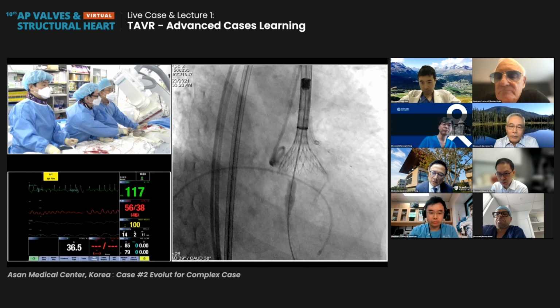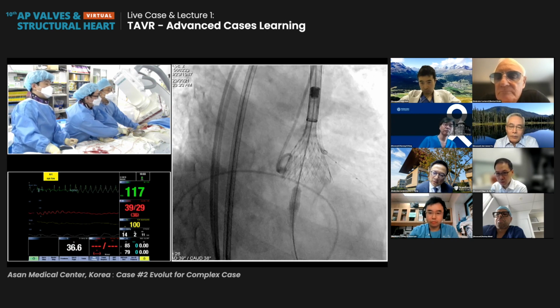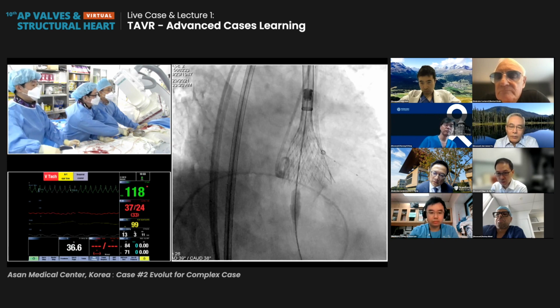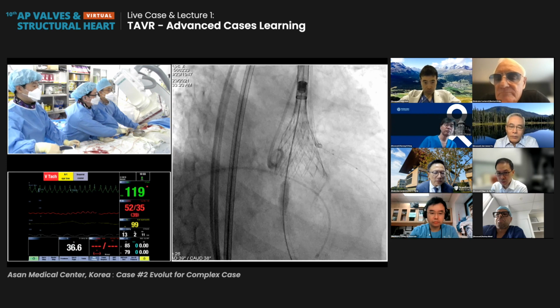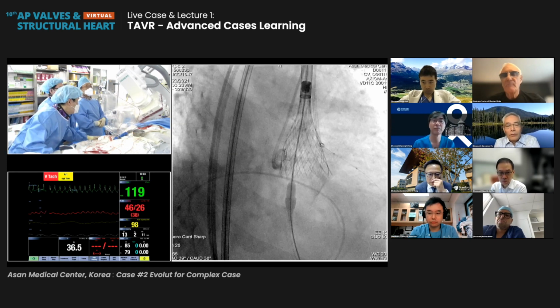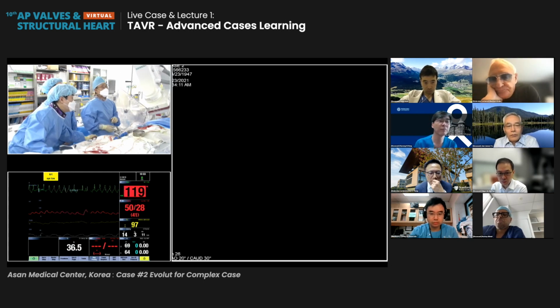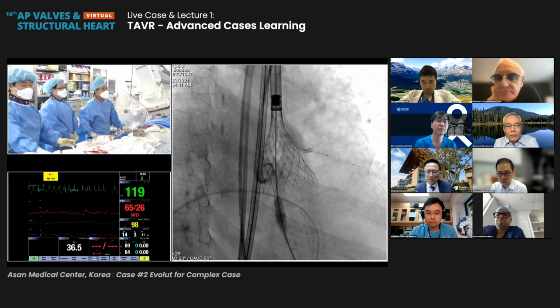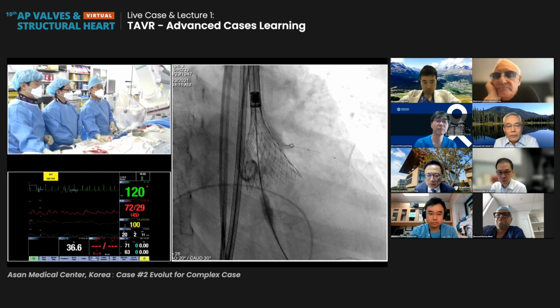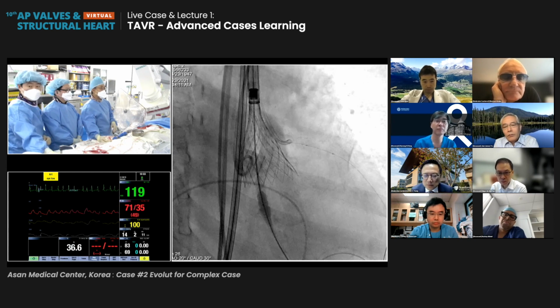자, 천천히. 자, 테스트. 자, 릴리스. 오케이, 릴리스. 혈압 조금 떨어집니다. 오케이, 릴리스. 올라갑니다. 오케이, 올라가죠? 네. 자, 트라이커스피드 뷰. 선생님. And stop the pacing. 네, 올라갔습니다. 나쁘지 않다. Blood pressure is okay. 네. Diastolic press is going up.